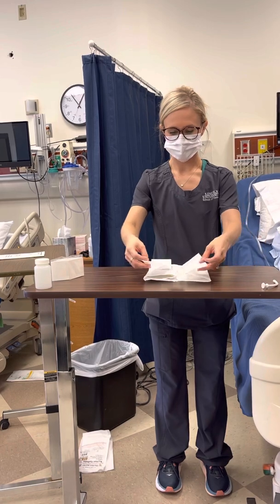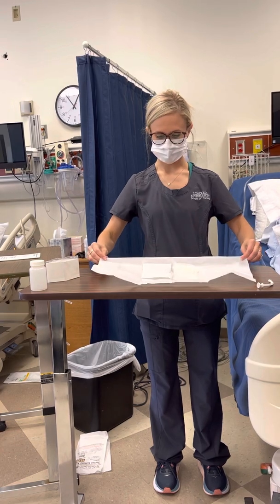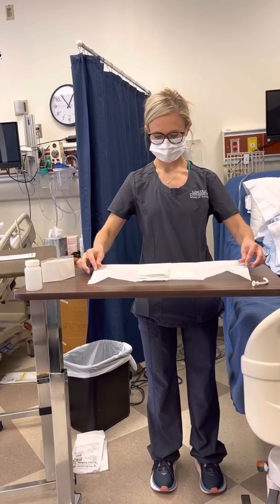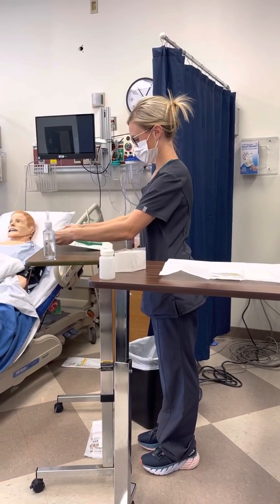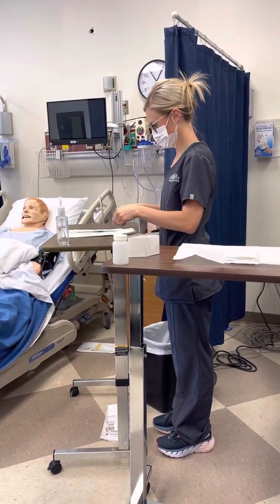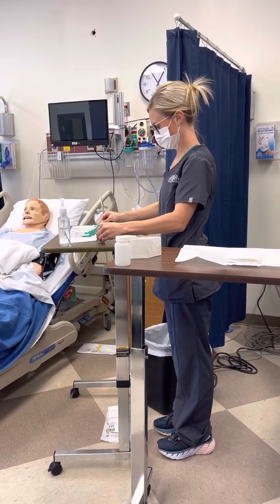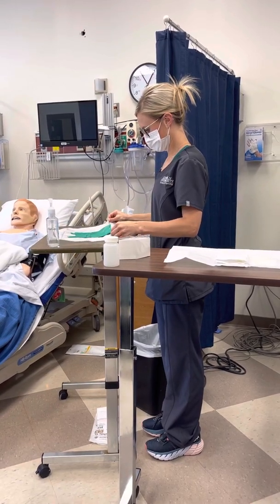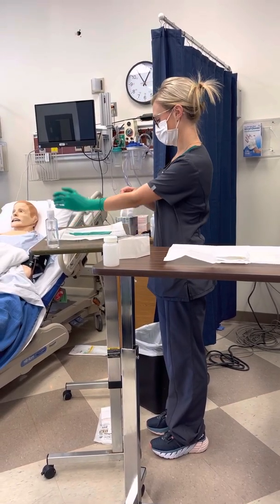I need to open my sterile field, making sure to be mindful of all margins when doing so. On go my sterile gloves.